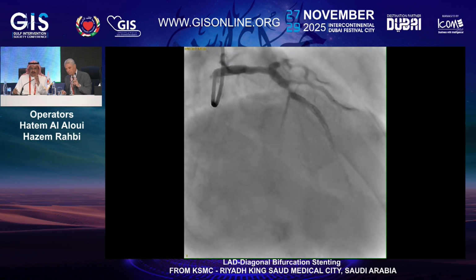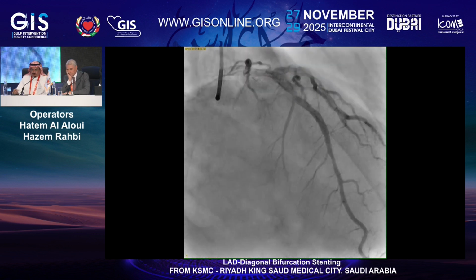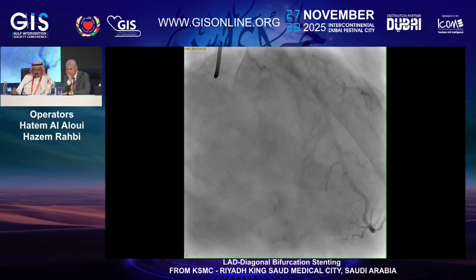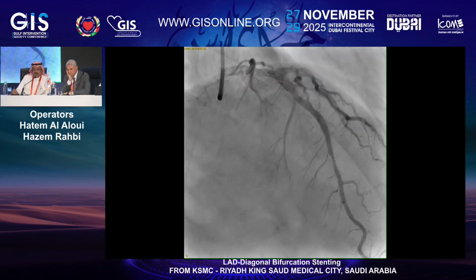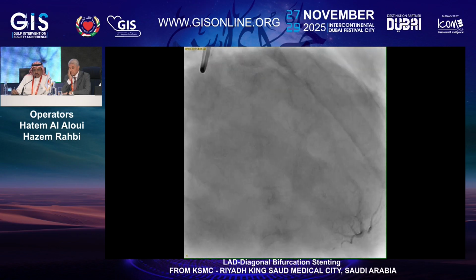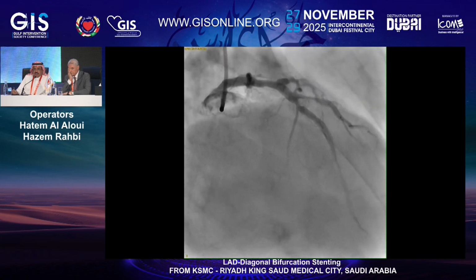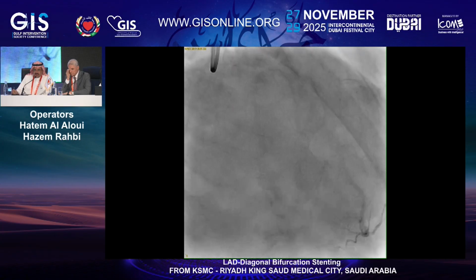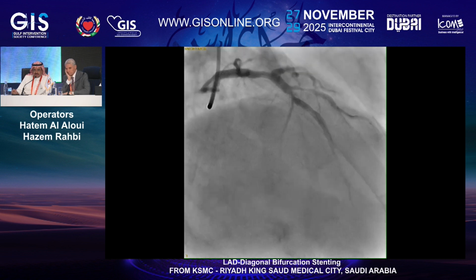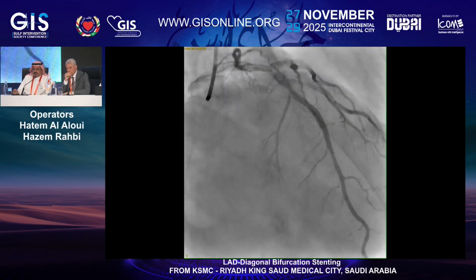Dr. Khalid? Well, I think 011 is not one of the commonest types of bifurcating lesions, but as I agree with the literature, provisional stenting is the preferred method to go. I'll do IVUS before the procedure to make sure that I have a good landing zone proximal to the lesion. If the vessel is reasonable, around 2 millimeter, and has good flow, then I reassess it after expanding the stent. And for sure, I'm going to protect the vessels in case there is a plaque shift.